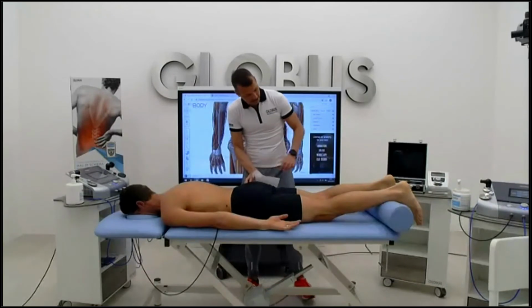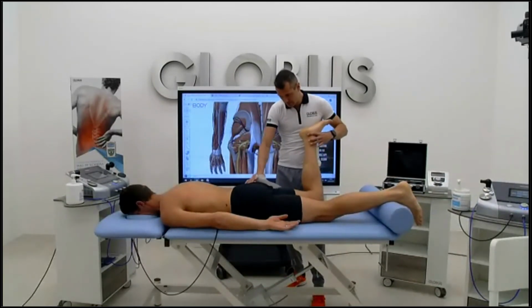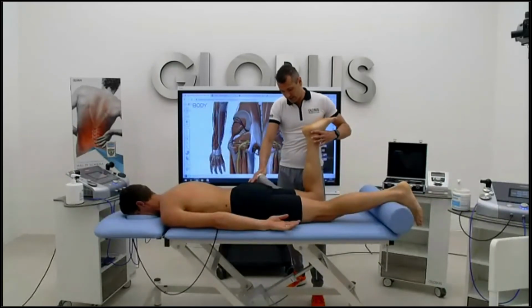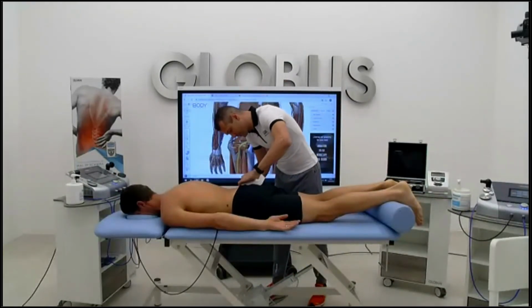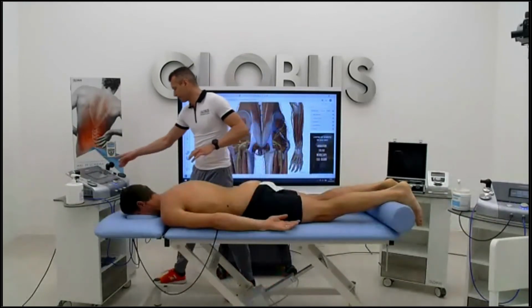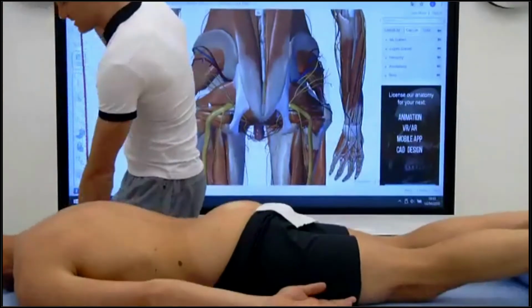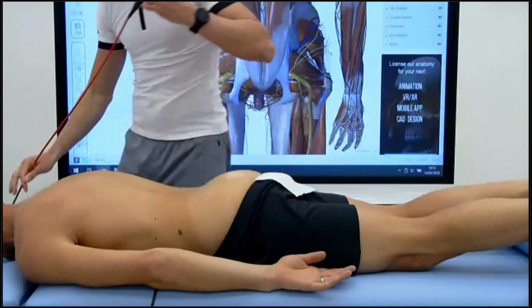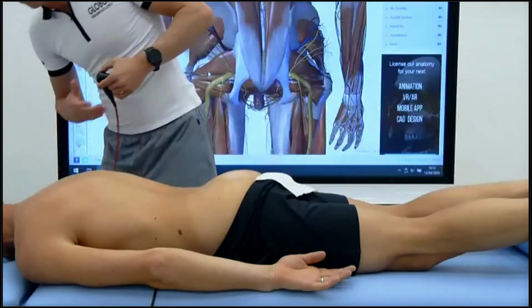We said that here there should be a restriction of the piriformis. Yes, and I can easily get a good idea. Yes, we have the perfect case. So we can start, for example, with a capacitive phase. I don't want to spend so much time doing the complete treatment, but the aim of this phase is to warm up the tissue.